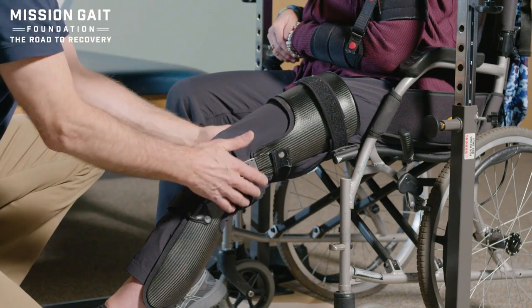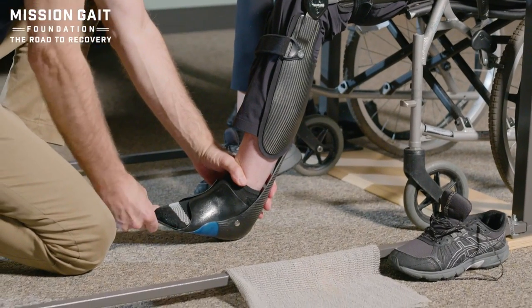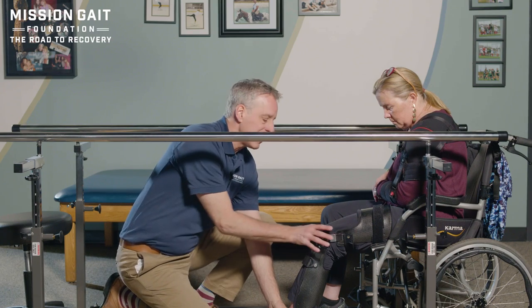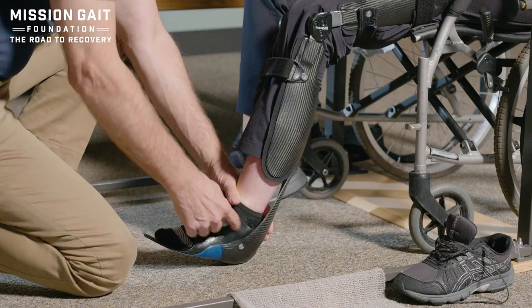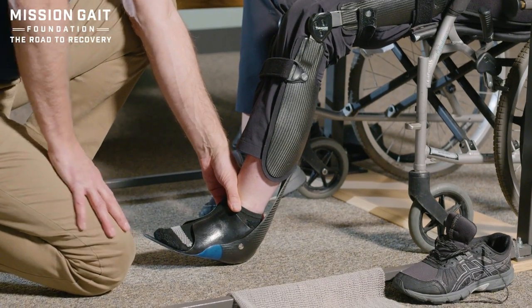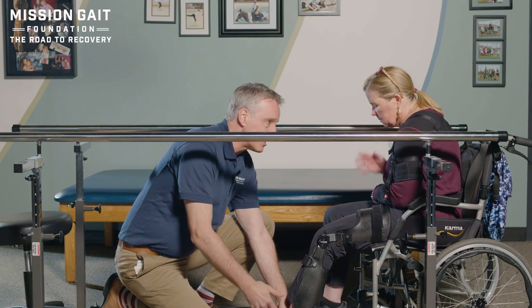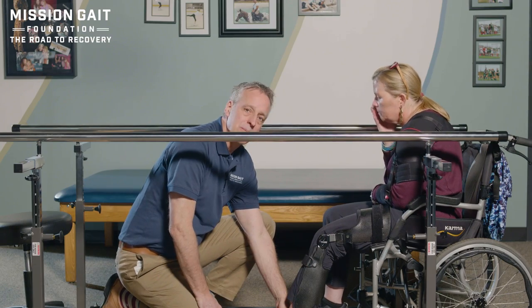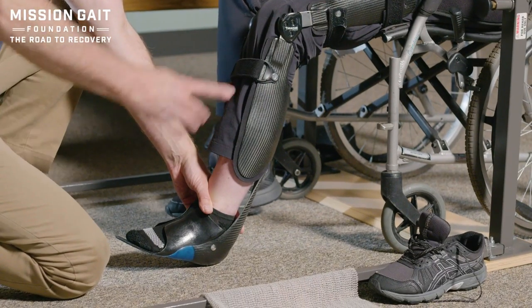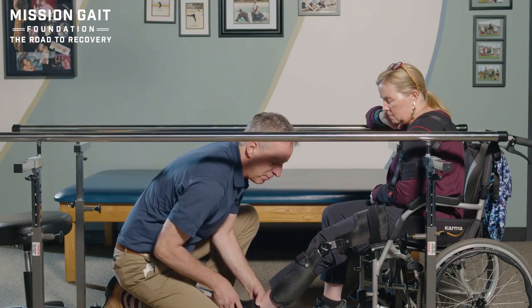That's going to keep her from going into that hyperextension moment. At that point I want to take a quick look at the brace and see: do we have a good fit? This should come from the orthotist, and it should all be done, but I don't take that for granted — I always want to double-check with the patient. Is everything fitting like we need it to? Do I see any areas where it's going to rub on her foot, where it could cut into her, where it could cause skin irritation which she may or may not feel? If she doesn't feel it, that can be worse because she can develop a wound on her foot. Now, we want her to walk always in a shoe, but I like her to stand the first time in a stable position without the shoe so I can make sure everything is fitting right in the AFO component.